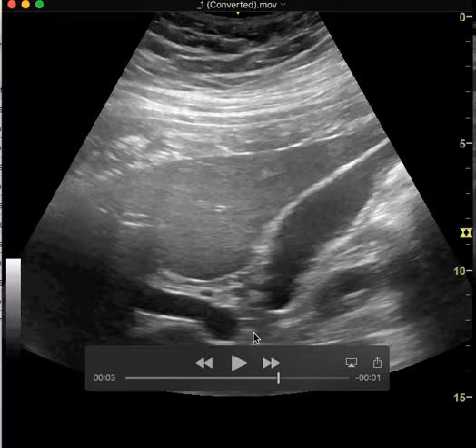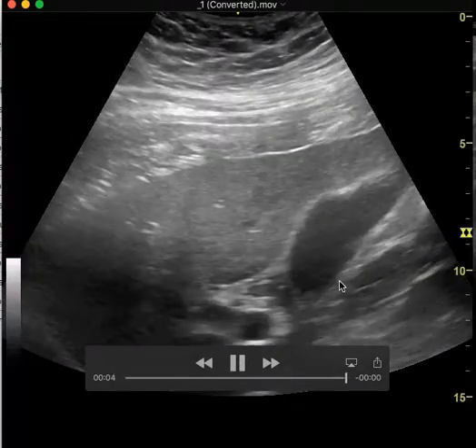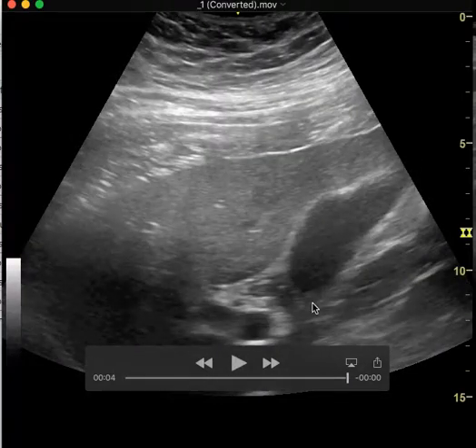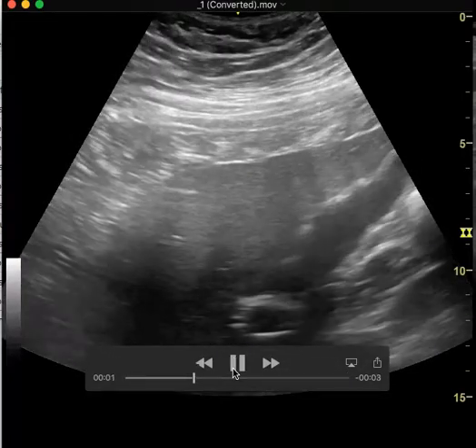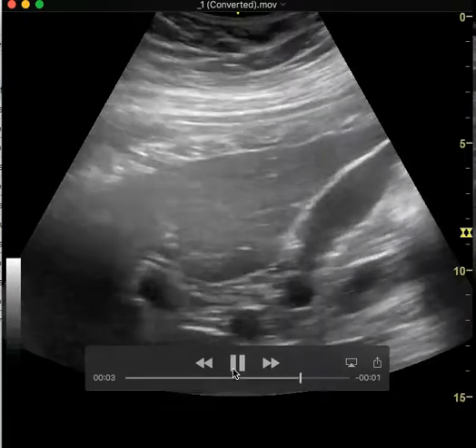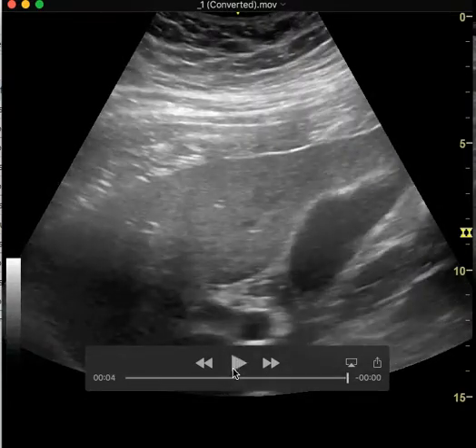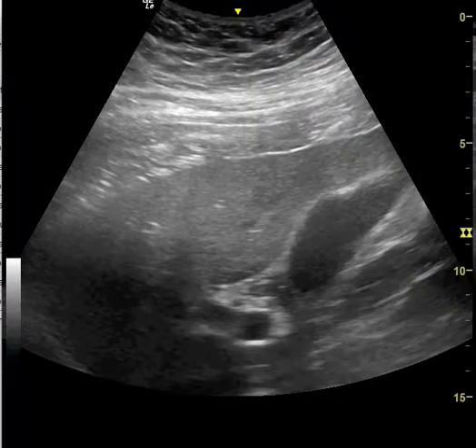The reason I'm making this video is to illustrate that I need to see more than just this one view, which is great, but I need to see the gallbladder in two planes. It's a 3D structure, so I need to see it both in long axis and also in short axis.